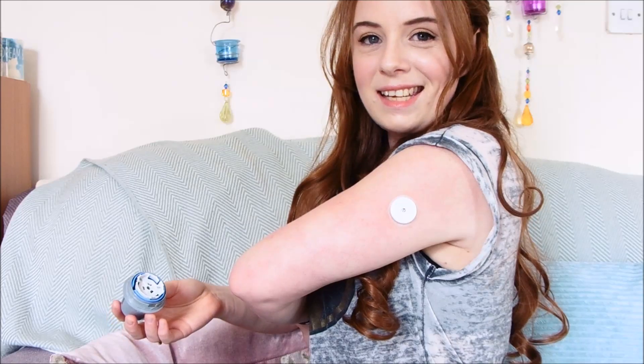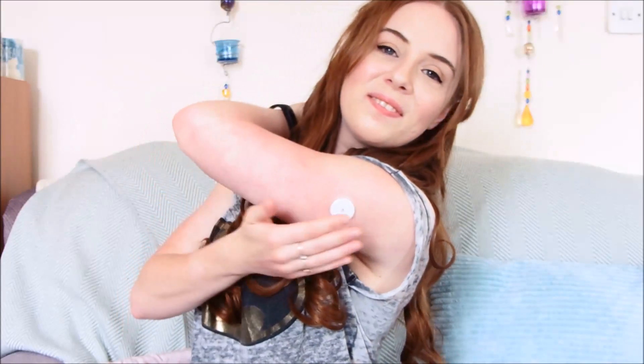So it's pushed down, it is inserted, it is in my arm. And then just gently wiggle, and you've got the sensor stuck on your arm. The needle is in the inserter — this needs to go in your sharps bin. So you might need to get one of those massive, hideous-looking yellow sharps bins. There we go. It's so easy. If I can do it, anyone can do it.